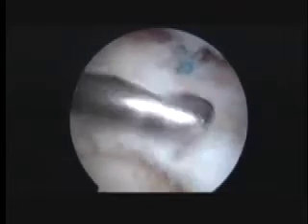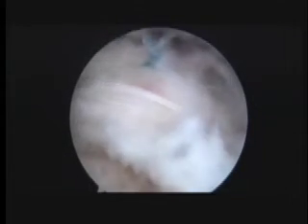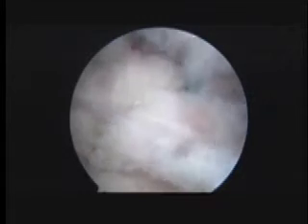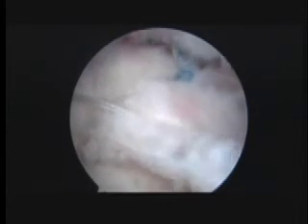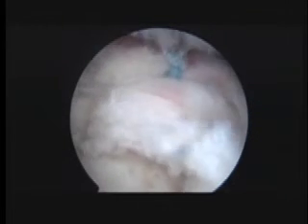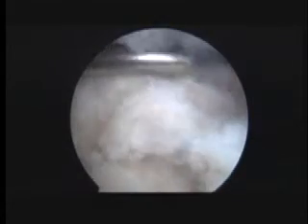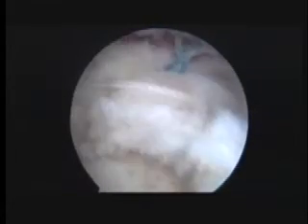Things look pretty good. I'm going to show you the finished results here in just a minute once I finish tying this biceps tendon suture. One more half hitch and then we'll be done with this suture. Okay, so we'll cut the suture tails next.